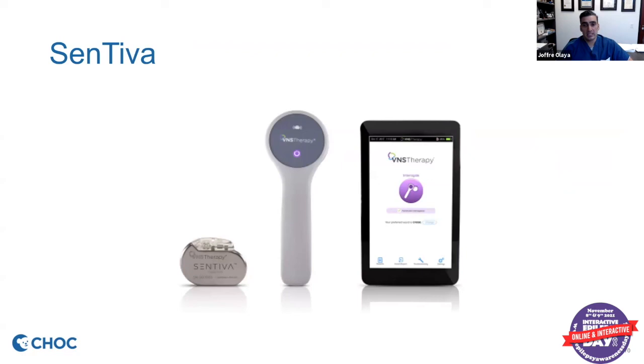And so once we get to a therapeutic level, then we'll leave it at that setting. But there's lots of different things that we can change. We can change how strong the signal is, how frequently the device goes off, and things like that. So typically the epileptologist will manage that to help optimize the seizure control as best as possible.